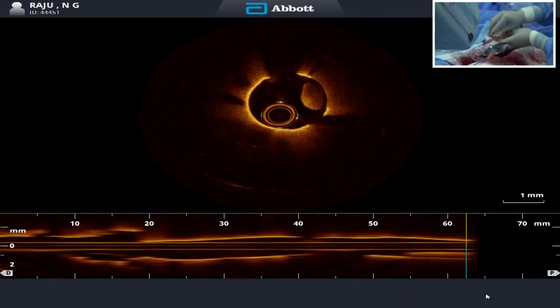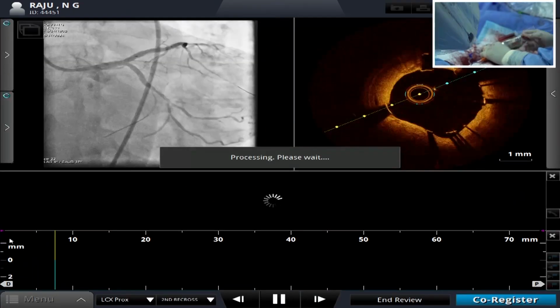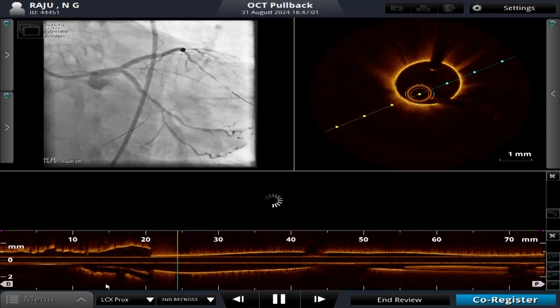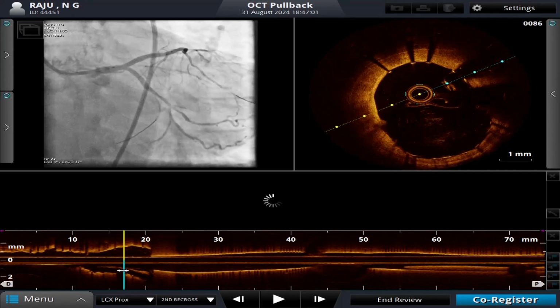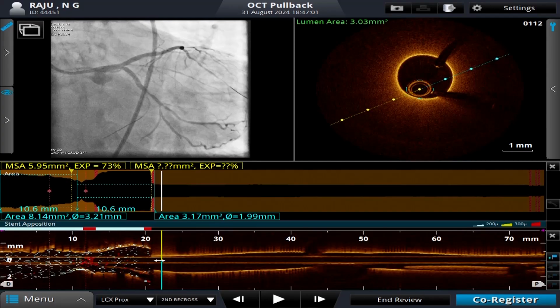Sir, during routine procedures like bifurcation, do you confirm it all the time with OCT for the recrossing? Almost always, if it's left main bifurcation, but if it's LAD D1, we usually do not do that. Okay. And again, if the patient is sick, with borderline blood pressures, we don't inject contrast that way. Here now the BP is good. That's the reason. 1.5 balloon.